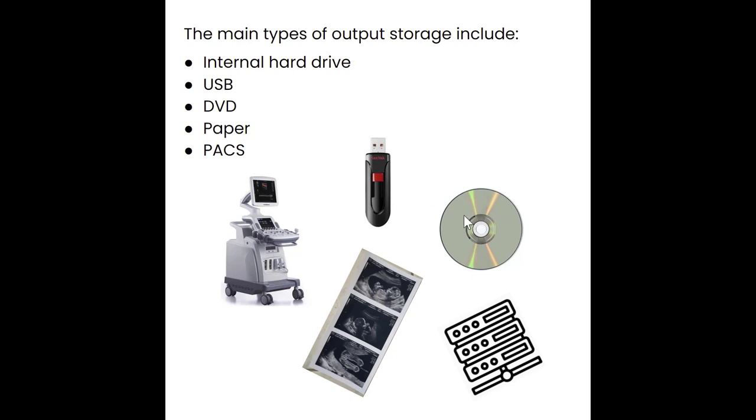Now, the other big thing that we often see in the ultrasound world are baby pictures. Those are typically printed out with a thermal printer that's connected to the machine, and those are usually used as keepsakes for the newly expectant parents. So these three storage systems are pretty straightforward. We're very familiar with these.